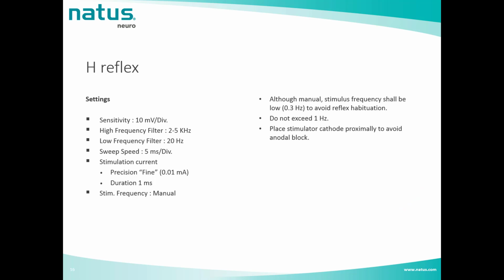In terms of settings, this slide provides you the optimal filters for such recording. The stimulation current should be of very fine precision. We should be able to have a very thin stimulus resolution. The stimulus duration is quite high, 1 millisecond, and the stimulus frequency is manual.